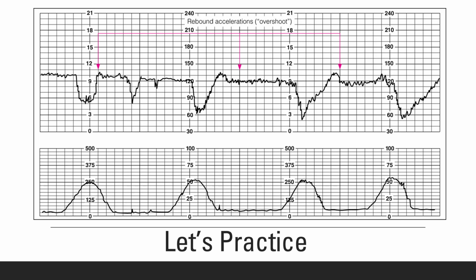And here are some variable decelerations. So you see your U's, your V's, your W's. There's an abrupt drop in the fetal heart rate. This can last for 10 seconds, 20 seconds, or even a minute on that last variable deceleration. You can see that decel is about 60 seconds long. So make sure you recognize what you see and how you will respond to the actual deceleration.